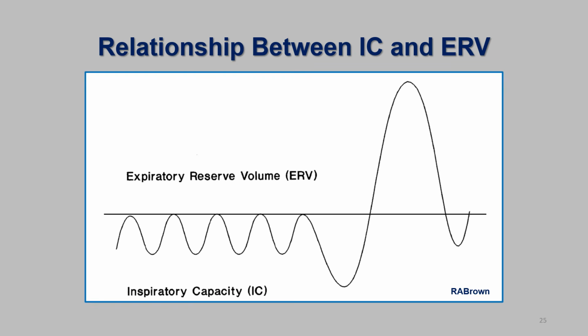The VC graphics morphology can guide the clinician to the type of lung disease being evaluated. For example, with emphysematics, despite severe airflow limitation during FVC maneuvers, the relaxed VC will generally remain within the normal limits because dynamic airway compression does not occur until the terminal portion of the VC expiratory maneuver. Additionally, because emphysematics breathe at a higher lung volume because of hyperinflation, they will commonly have a reduced IC with a larger component of their VC being comprised of the ERV. Chronic bronchitics and asthmatics will generally have reduced ERVs relative to their entire VC volume.